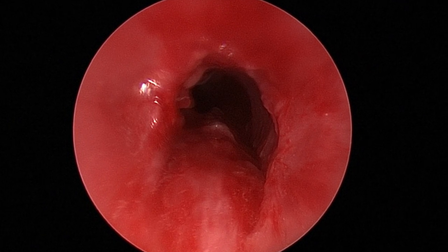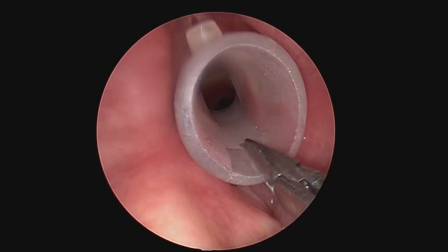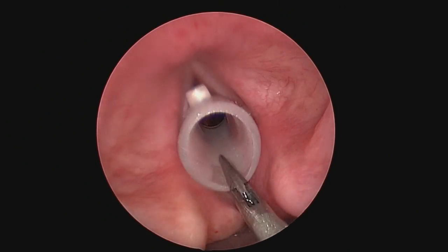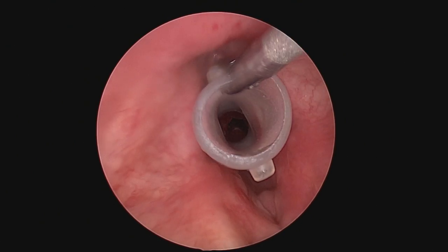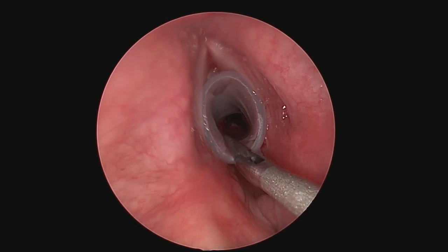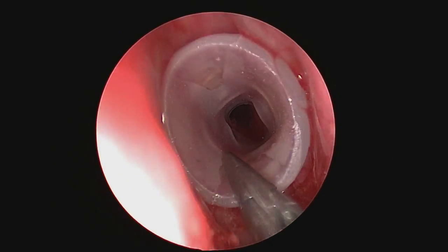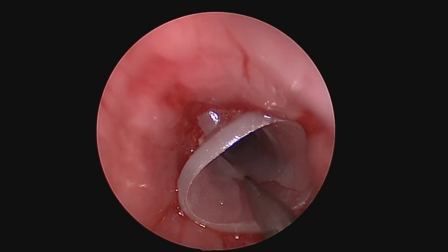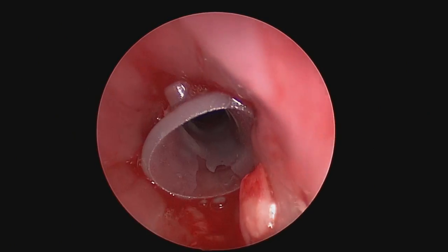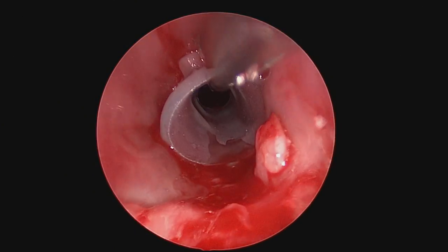Here's a still photograph of that. In this case, I decided to put a stent in — I put a Dumont stent in. Dumont stents work great, but they can dislodge and the patient can cough them out. So you have to oversize a little bit, which typically means it can be tough to put in. But if you use principles of pushing gently with controlled force, and push both up and down, left and right, you can get it into the right position.